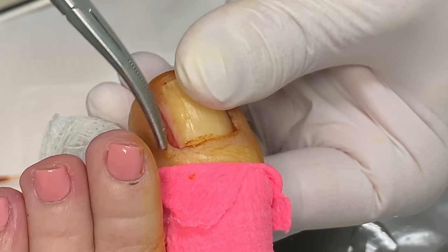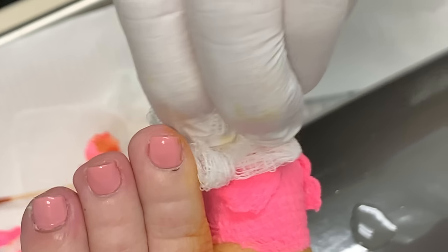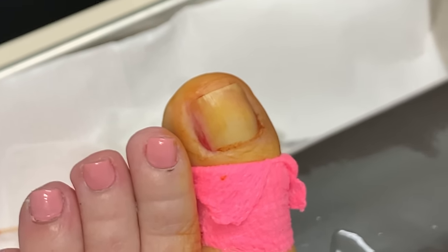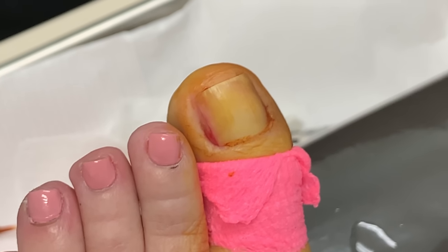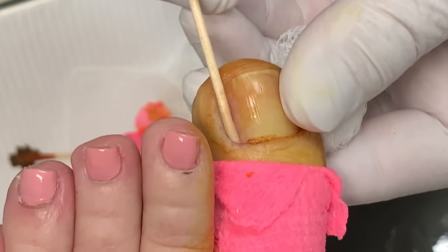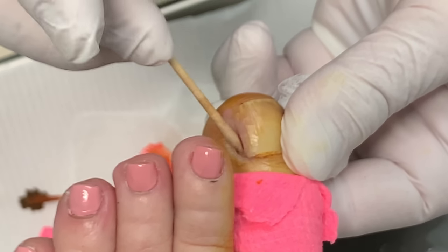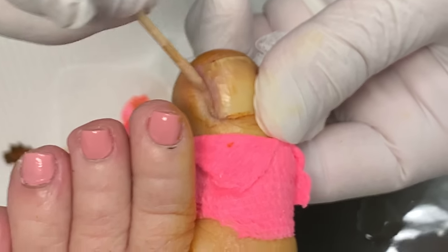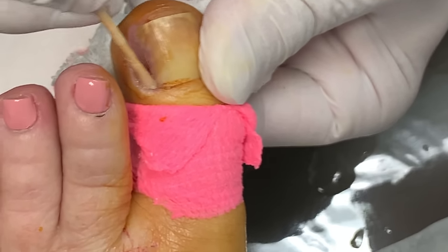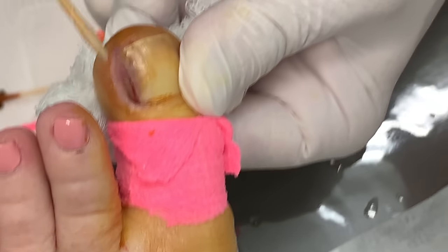I do not see anything hiding here. You can see how puffy it is right here. I'm guessing the pedicure person was digging in that cuticle, because that's what it looks like — you're swollen from somebody trying to do something to it. So we're going to put the chemical there. The amount of nail that I got is really about the size of this small cotton-tipped applicator. With the chemical burn, you can actually see really well inside of it — you can see down into the groove, you can see what it looks like where your nail was.